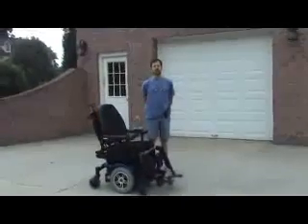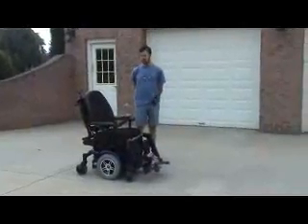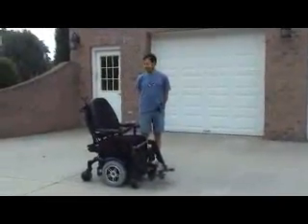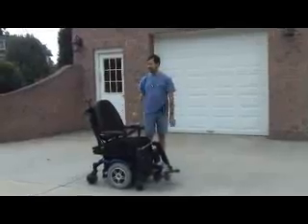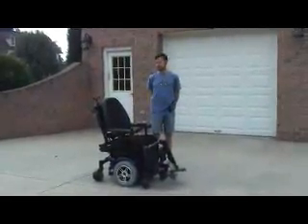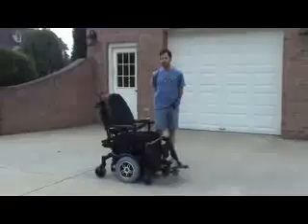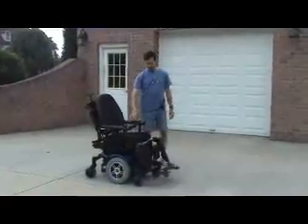Hi, I'm Dean Pomerleau from QA Tech and we're working on smart wheelchairs. What we have here is our Q600 Quantum top-of-the-line wheelchair. We just purchased it about a week ago and we are in the process of automating it.